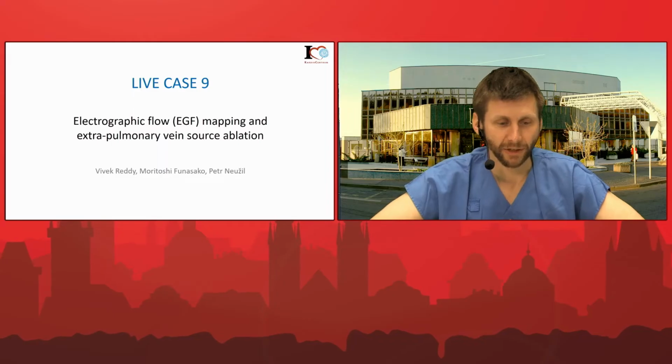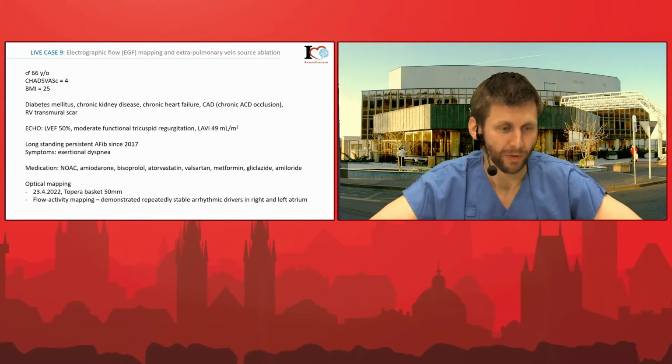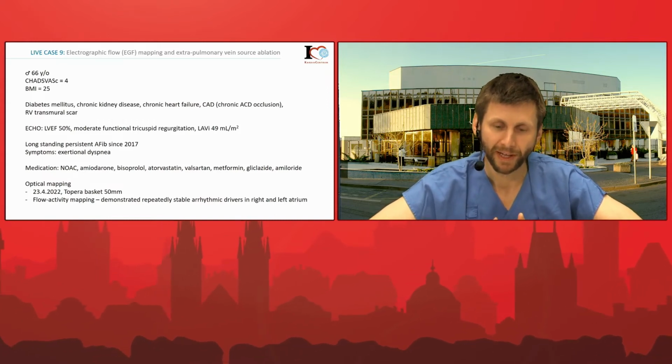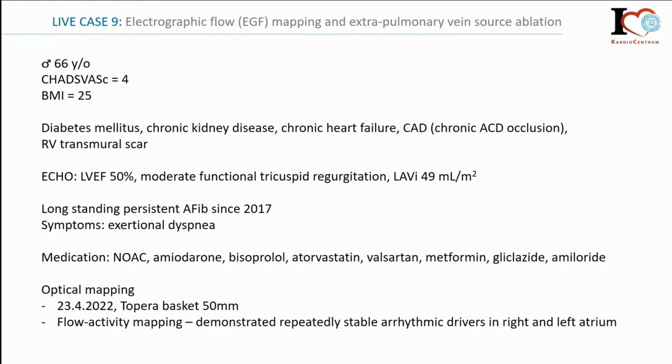So the next case is another AFib patient for electrographic flow mapping and extra-pulmonary vein source ablation. Here we have a 66-year-old male with CHADS-VASc 4 and history of diabetes, chronic kidney disease, and ischemic heart failure with chronic LAD occlusion. There was a right ventricular transmural scar on magnetic resonance. On echo, he has a mildly reduced ejection fraction, moderate functional tricuspid regurgitation, and an enlarged left atrial volume. He has a history of long-standing persistent atrial fibrillation since 2017, and his symptoms are exertional dyspnea. He's anticoagulated, and he's on chronic amiodarone treatment.